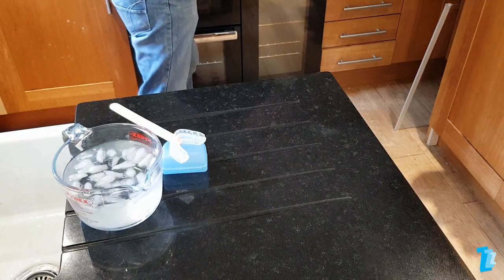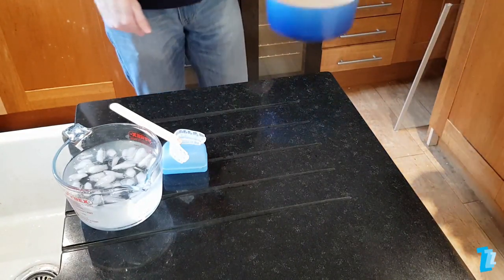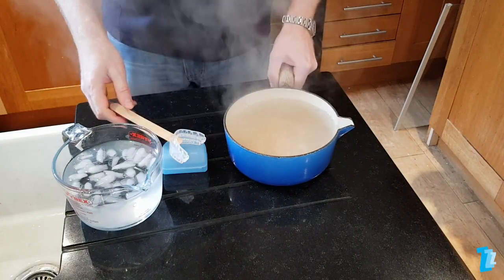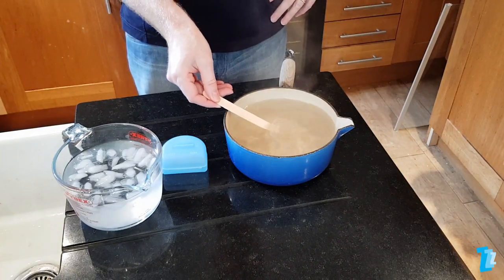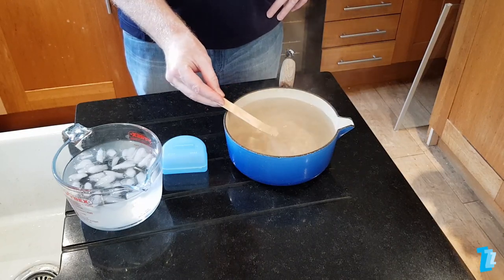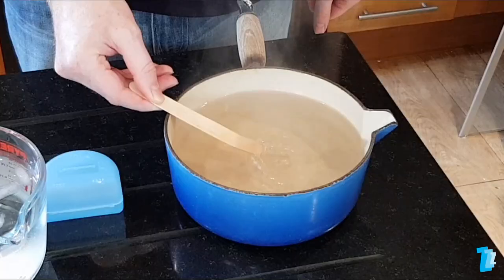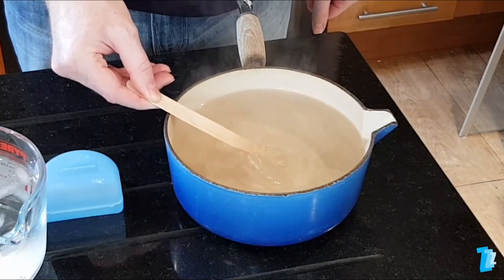Now take the saucepan of boiling water off the heat and wait a few seconds for the bubbling to subside. It is very important that you do not use a kettle or any other method of heating the water for this part of the fitting process. Slide the device into the water so it's completely immersed, ensuring it's not touching any part of the saucepan, and very gently move the device in the water, carefully turning it 180 degrees midway through. Avoid vigorous movements as this could cause the device to collapse in on itself.